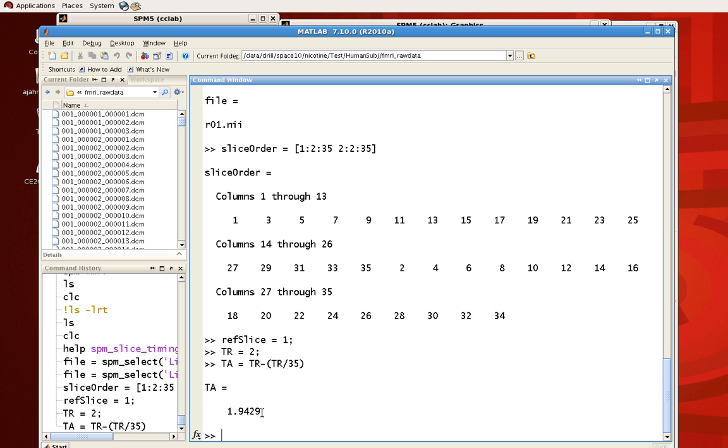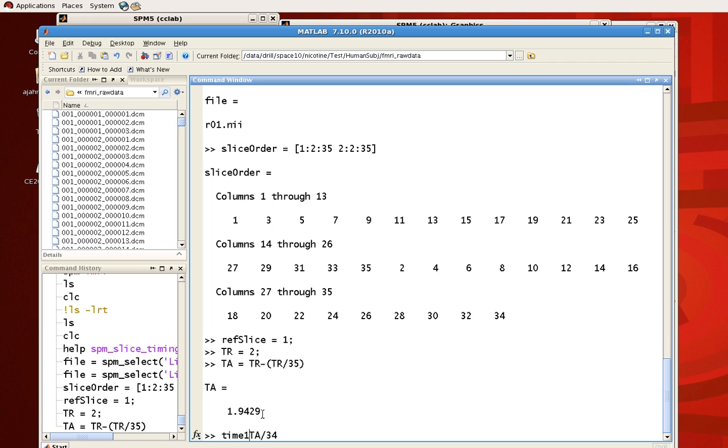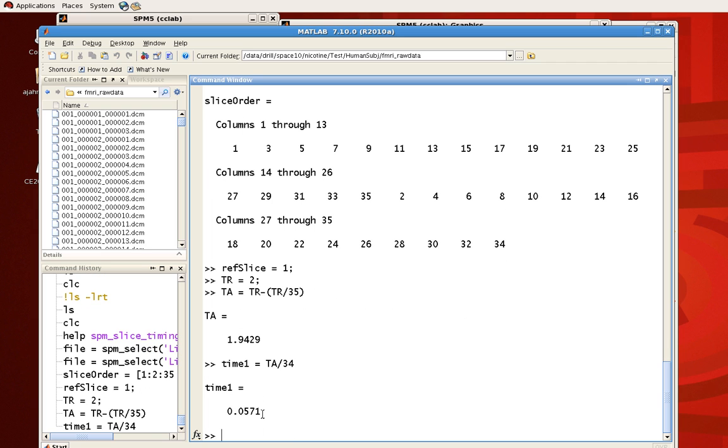In other words, this is the time point at which the last slice was acquired. So if we want to know the spacing between all the slices, we can divide TA by the number of slices, which is 35 minus 1, because this is at the point where the last slice was acquired. Let's call that time1. So about 0.057 seconds between slices. Now the difference between when the last slice was acquired, which is 1.94, and the next volume, which is when the next TR hits, would be the TR, which is 2 seconds minus TA.